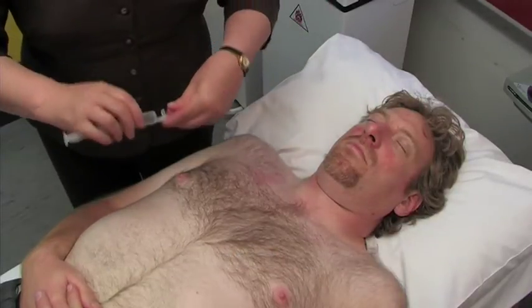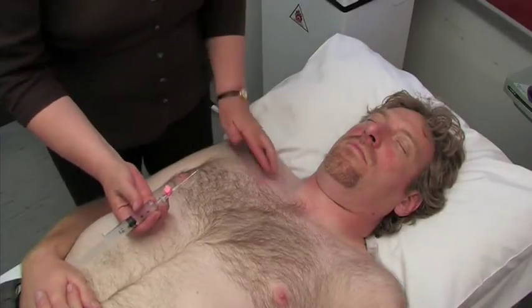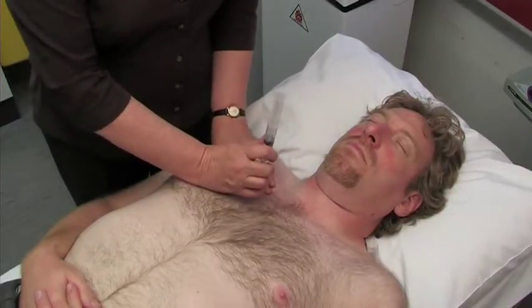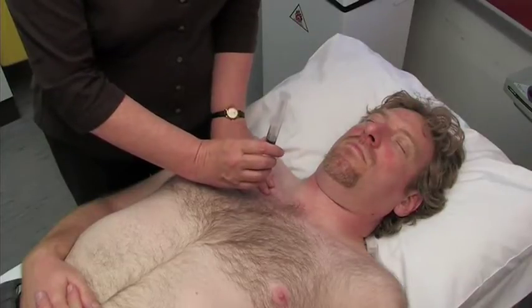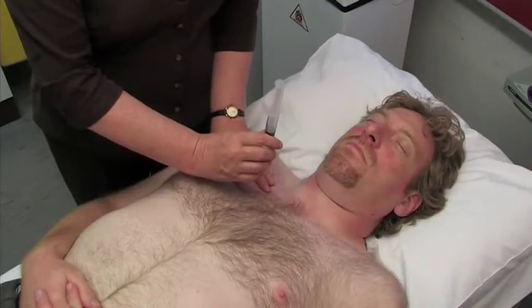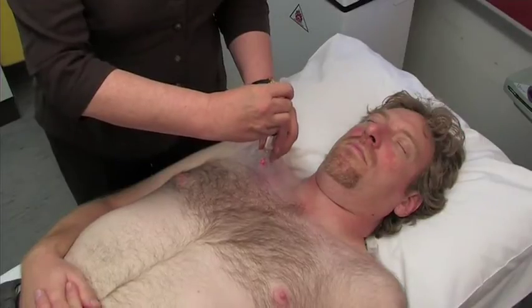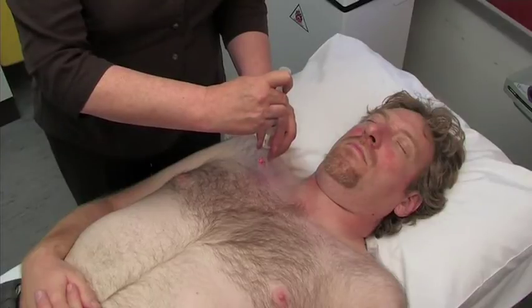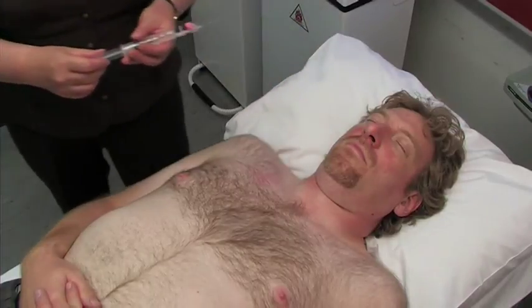Attach your syringe and then just remove the needle sheath. Re-identify your area and then put the needle right up to the hilt into the chest, going at right angles to the patient. Once entered, you will find that you can see air clearly entering the syringe, and you have relieved the tension pneumothorax.